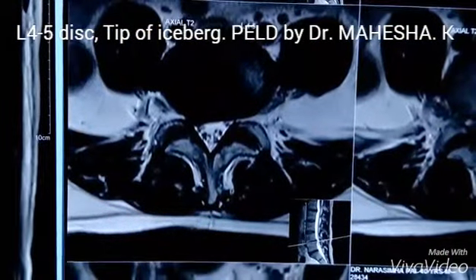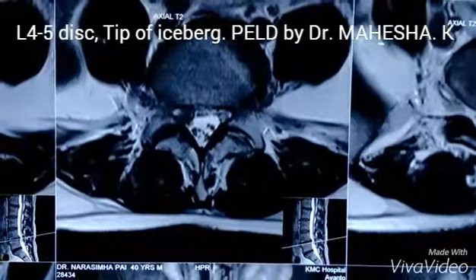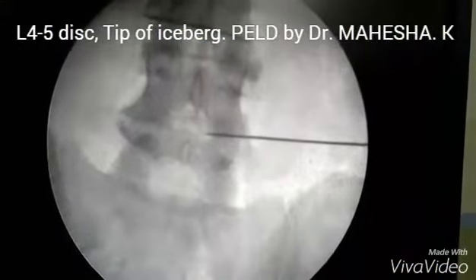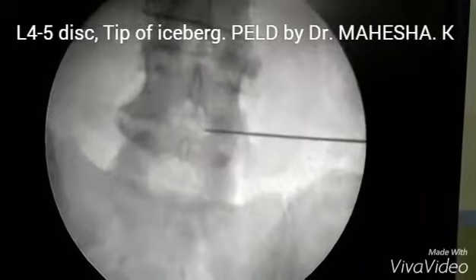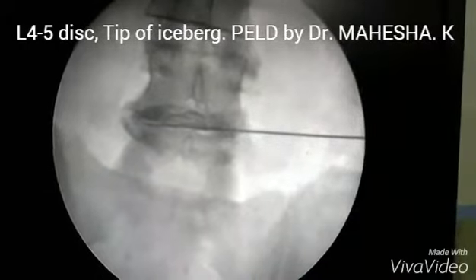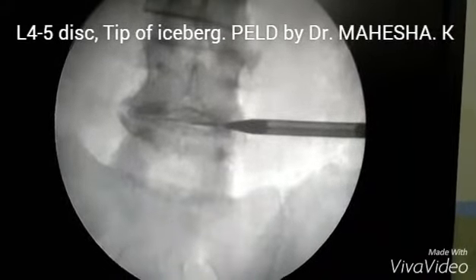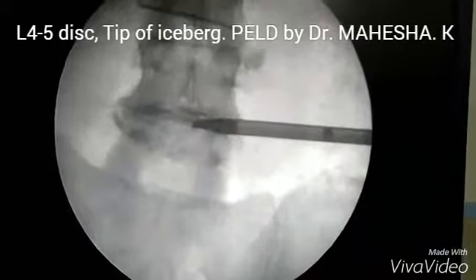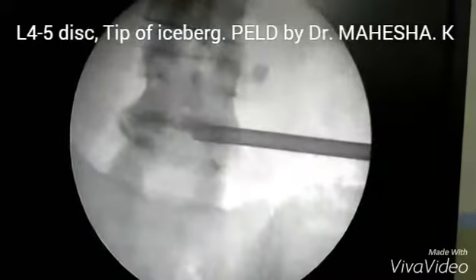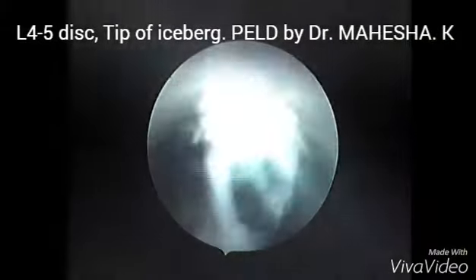Though the herniation appears to be very small on the MRI, the patient has significant symptoms and it requires surgery. I have inserted a needle followed by a guide wire, then a dilator and a cannula using a transforaminal approach into the L4-L5 disc space under image control. Then I insert an endoscope and further surgery is done using the endoscope.